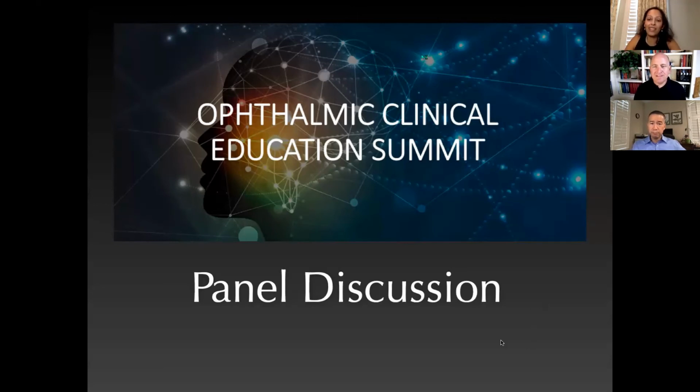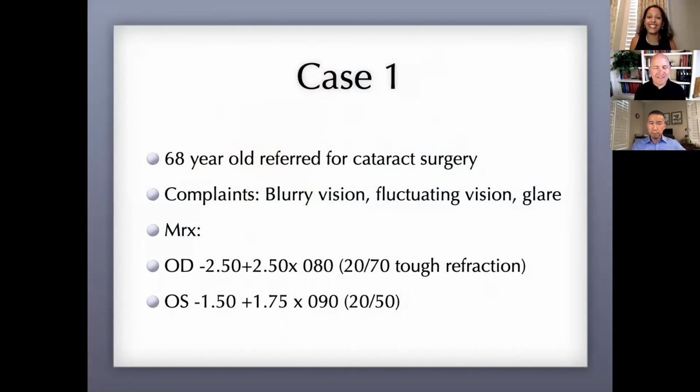And with that, I'm going to share a case. A 68-year-old patient who was referred for cataract surgery, with complaints of blurry vision and glare. But of course, Daniel mentioned it.